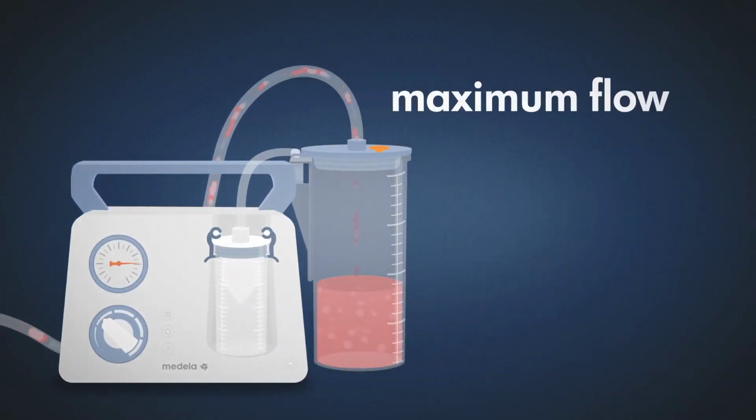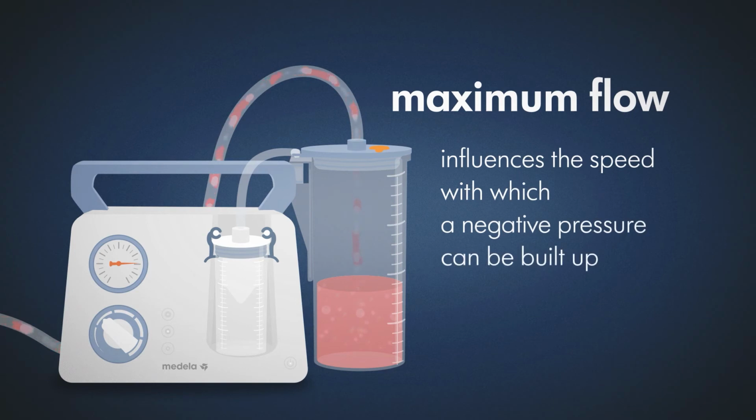When extracting, the device's maximum flow rate is an important criterion. It indicates how quickly negative pressure can be built up at the beginning of therapy and the maximum volume that can be drained in any given period of time.